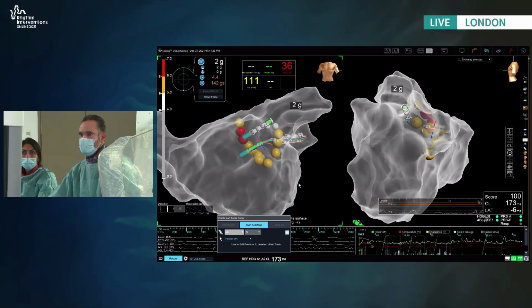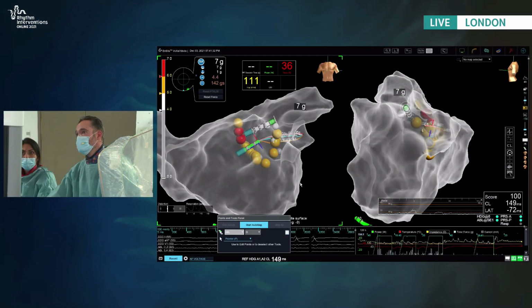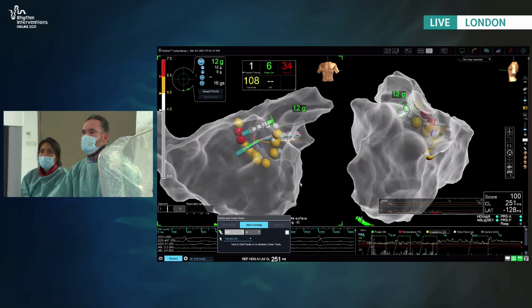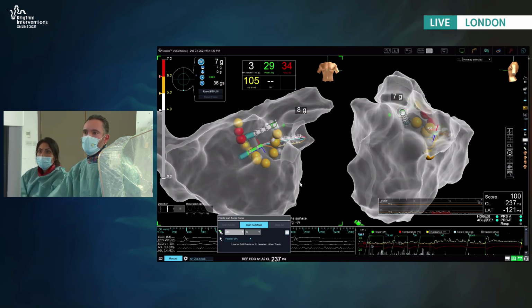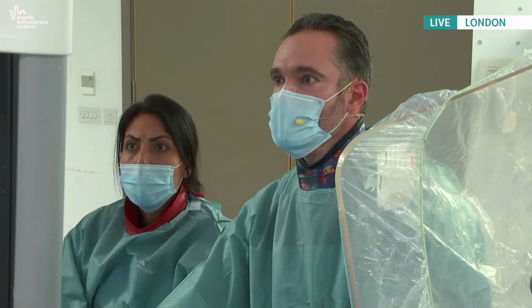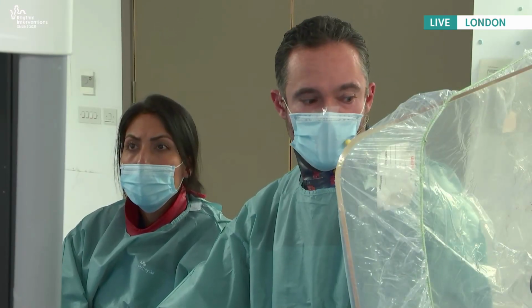So he's snoring just a little bit right now. And he's had 3 milligrams of diamorphine, 1 of midazolam. So it hasn't taken an awful lot. I suppose it does get to be a problem sometimes if people are over-sedated, particularly with benzodiazepines. They can get a little bit agitated. So I suppose a careful balance. But this gent's doing very well.